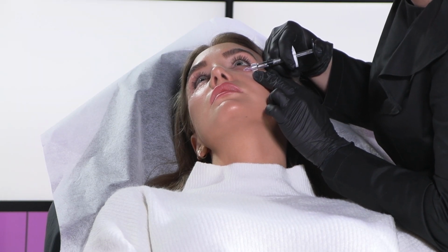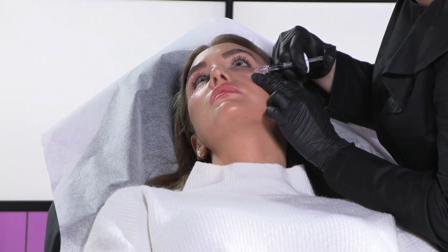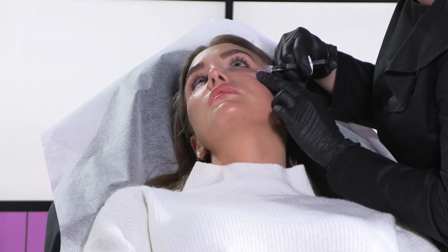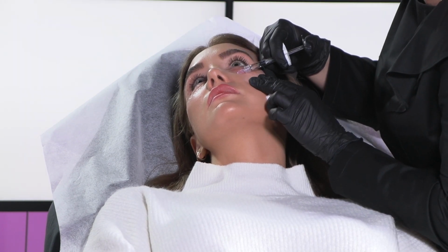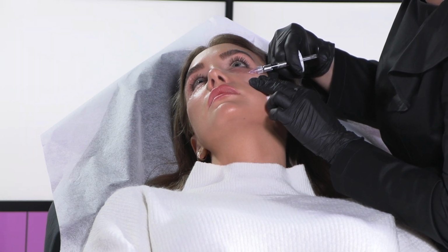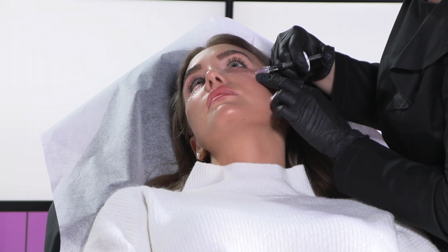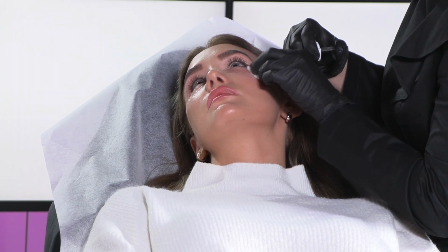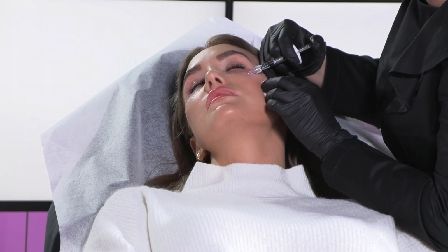Because if the vessel system is very active, you see it. Of course, you won't create a bruise and inject into the small vessels. Everything can happen, but we want the best for the patient. The treatment should be repeated in 2 weeks, max 3 weeks, but I prefer 2 weeks. Is it okay?